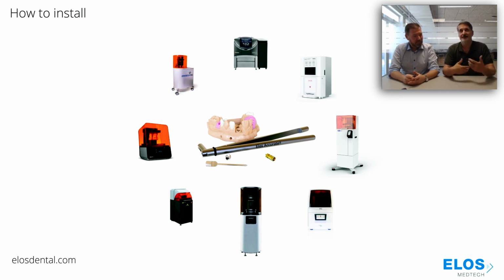So this comes more and more. Now you have more automatic washing stations, curing stations, and all this. And people are often very focused on the hardware side, so what is the layer size and the resolution and all that? But there's much more. You have different light sources, different light exposure, different light intensity, or different movement speed of the platform, different viscosity of the material. So a lot of influence factors running around this 3D print process.